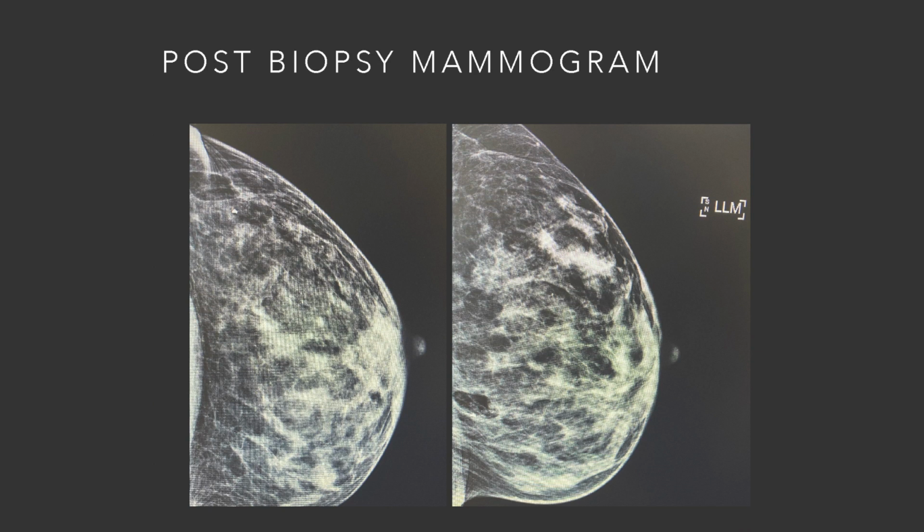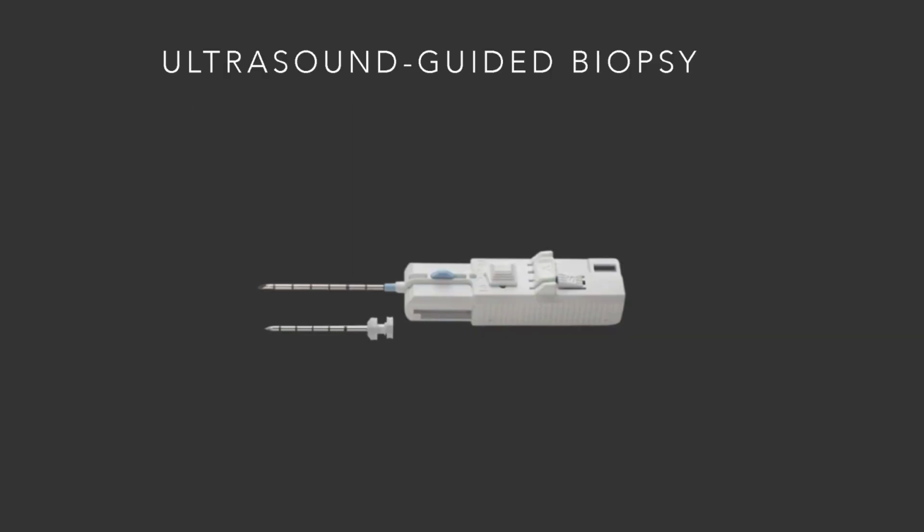And then this is just a post-biopsy mammogram, which we always do to look at the location of the marker, and we may comment on whether there are remaining calcifications. So this is an example of an ultrasound biopsy device. There are a number of them. This is one.